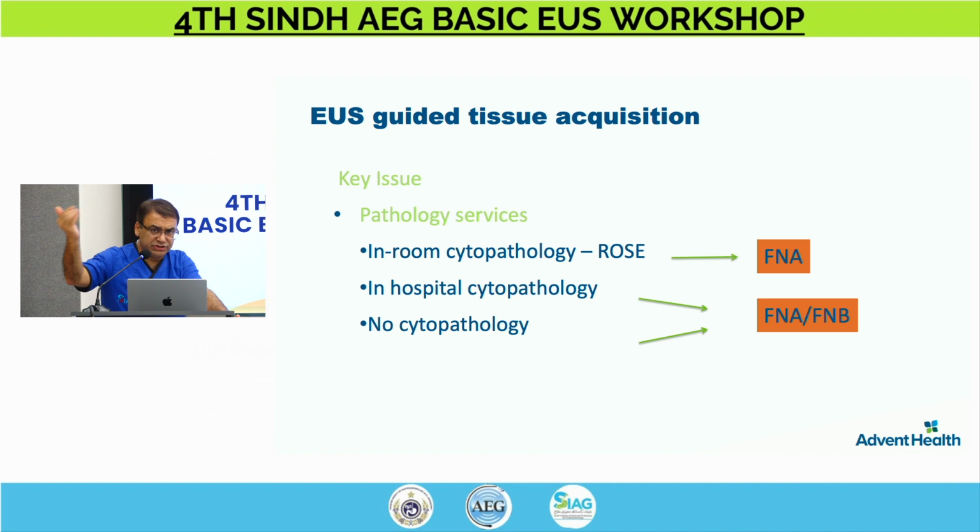Get the specimen, put it into the formalin, and send it to the lab. What you're looking for is tissue, not a blood clot. The tissue is going to look white, and if you see it's all red, you can shake the specimen a little bit, and sometimes the clot separates from the tissue and you see the white specimen in there.